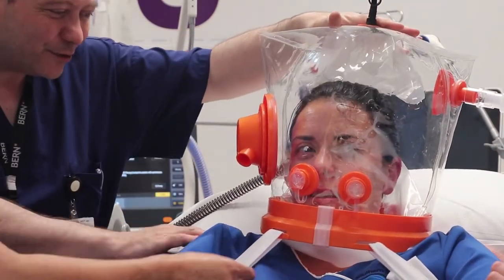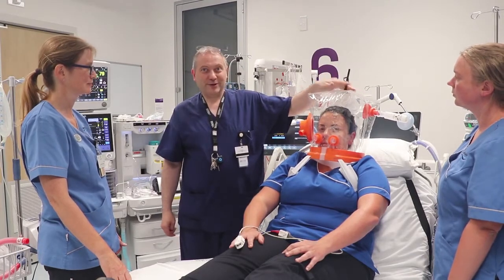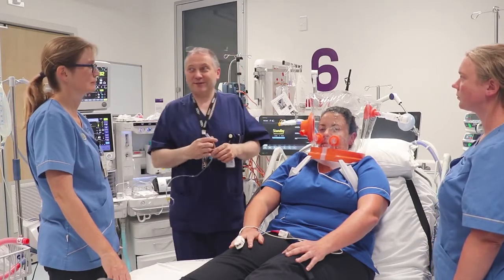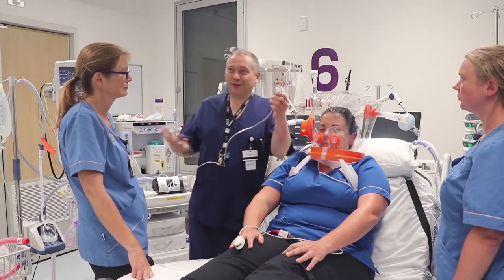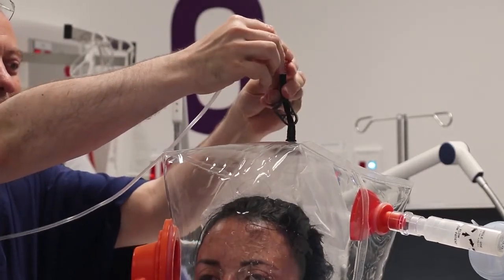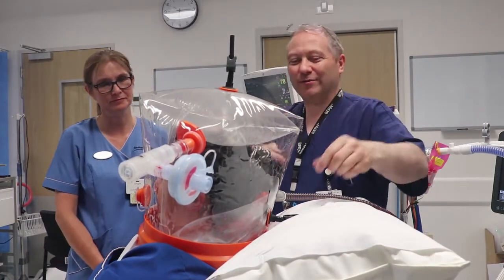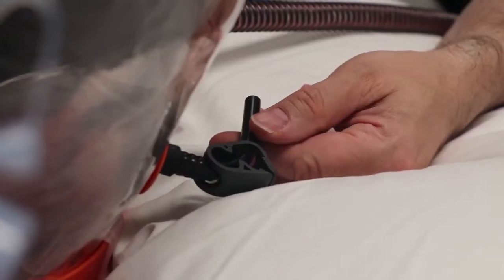Carla is asked to sit forward so we can tighten the straps at the back. Next we inflate the top cuff and the neck collar cuff. This can be done with a standard luer-tip syringe, or using the oxygen or air supply from the machine. Inflating the top cushion fills up and reduces dead space in the helmet. Finally we inflate the collar cuff that goes around the patient's neck, which improves patient comfort.